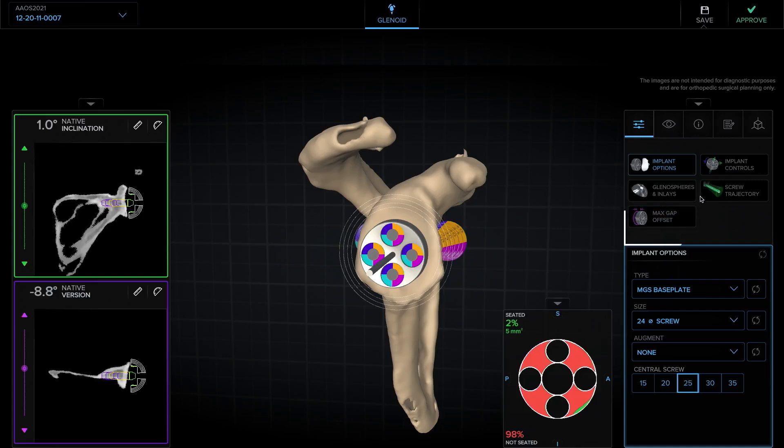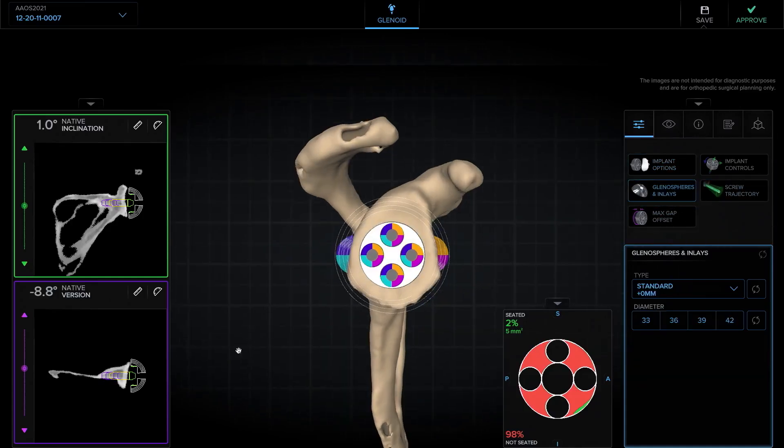Next, I like to size the glenosphere. I typically will choose the glenosphere on this axial view, making sure that it covers both anterior and posterior — at least flush anterior and posterior. This looks about a 36, and that seems to cover pretty well.